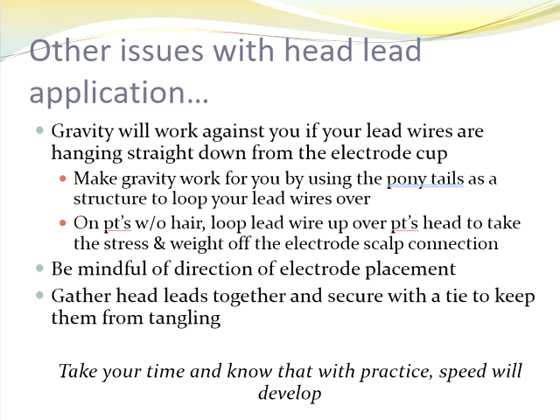So when you're first starting out with applying and learning how to measure and apply the head leads, take your time. With practice, speed will come. Don't start rushing it right off the bat. Really focus on accuracy first.